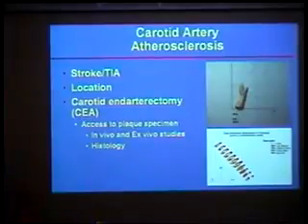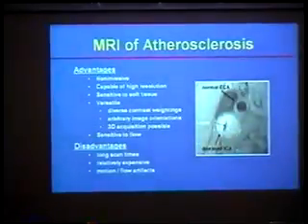And once we do this, we have also developed a pretty extensive way of looking at histology. We prepare the entire specimen for histology, and then the sections are cut along the entire segment like this. Once they're stained, they can be digitized, and the digitized sections can be outlined by pathologists for what tissues are present, forming a 3D map like this.